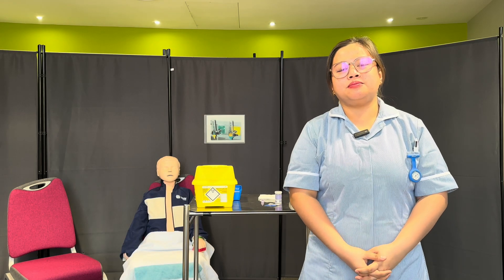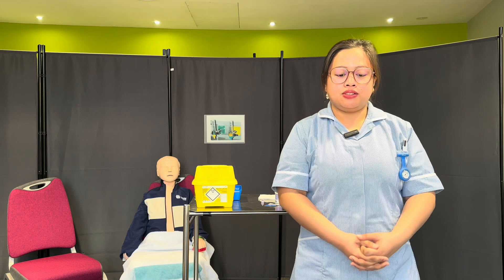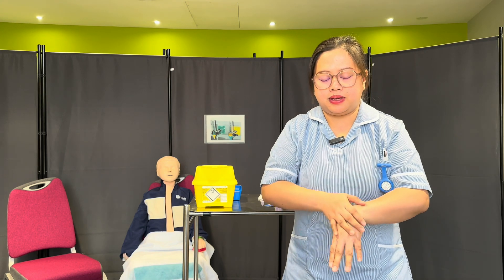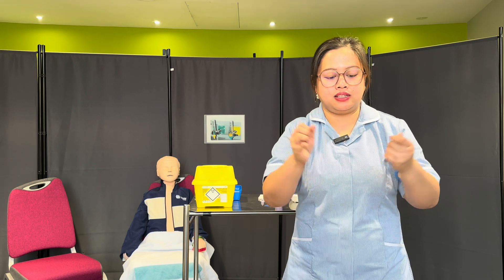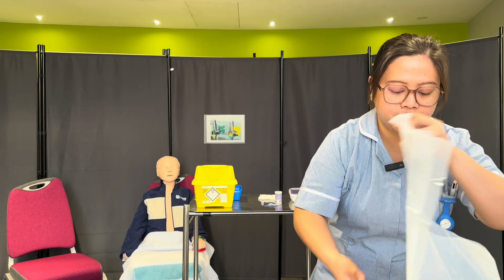So in this scenario, safety and identification checks have been completed, so I'm just going to do my hand regime. Thumb to palm, back of the hand, fingers interlaced, fingers interlock, thumb in rotation motions, fingertips — and let it air dry for 20 to 30 seconds. Now I'm going to don my apron.